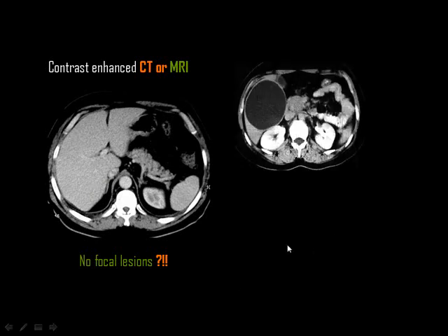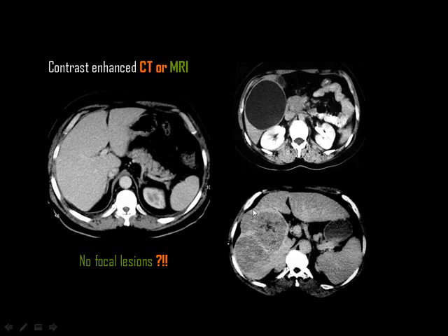But if you perform a CT scan and you see this filling defect which is cystic, it contains something like water, and this is another filling defect which is solid, almost similar to the hepatic parenchyma. Then you have cystic lesions and solid lesions. In radiology, we usually consider cystic lesions benign and solid lesions malignant. Then we have four benign lesions in the liver that are cystic.